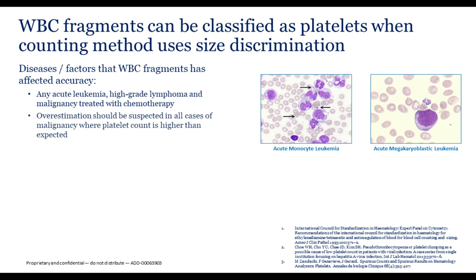WBC fragments can also be classified as platelets. Smear review shows small white blood cell fragments around white blood cells. In any acute leukemia, high-grade lymphoma, or malignancy treated with chemotherapy, these can be a major contributor to a falsely increased platelet count. You should always be alert that overestimation should be suspected in all cases of malignancy where the platelet count is higher than expected.